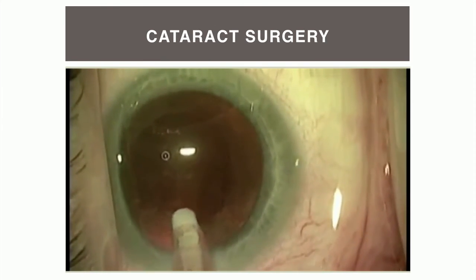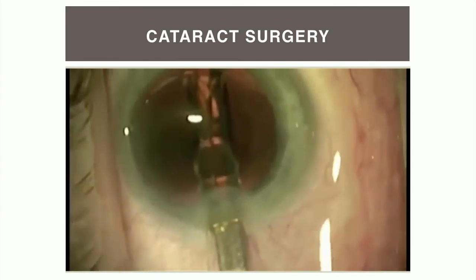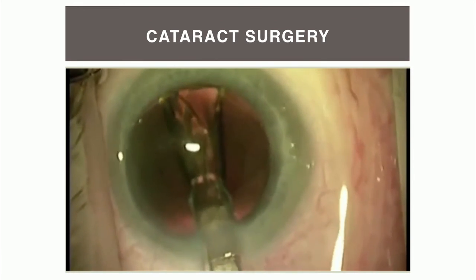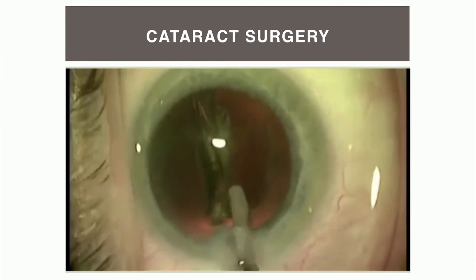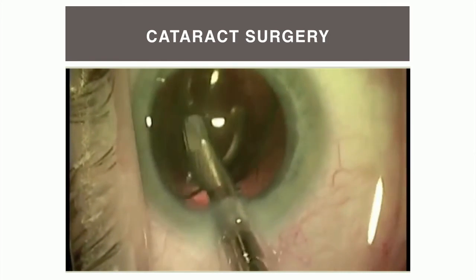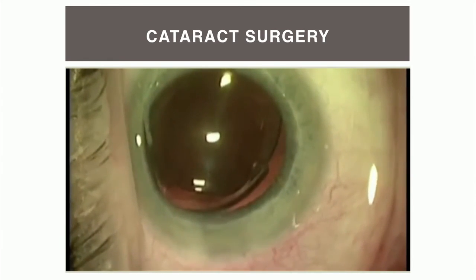They're removed with basically just a vacuum device. And now what's done, now you're seeing the intraocular lens being placed within the capsule that used to hold your cataract. And that's it.